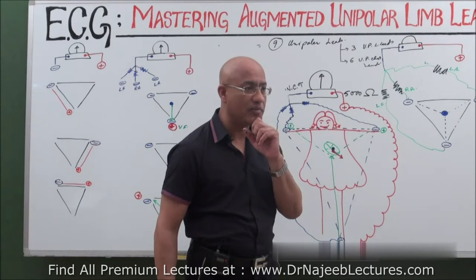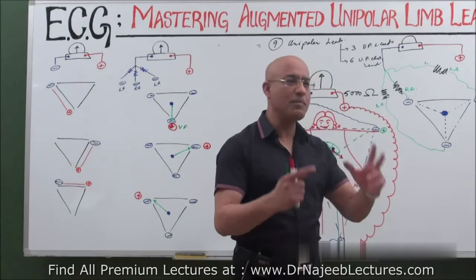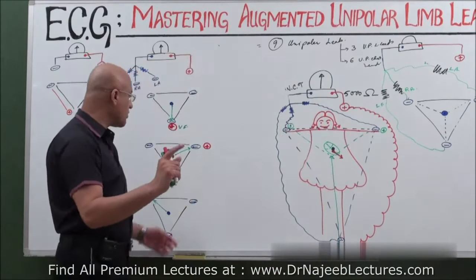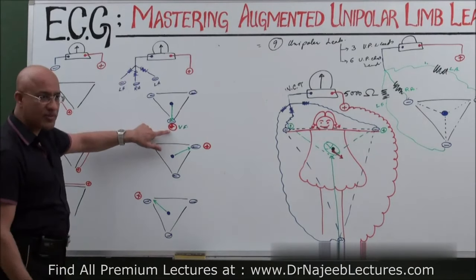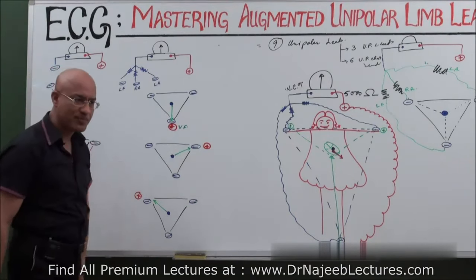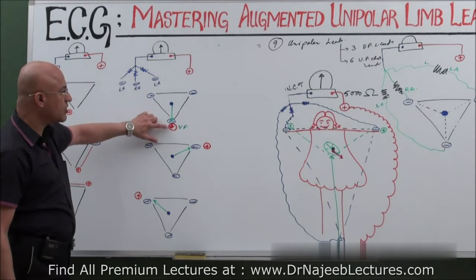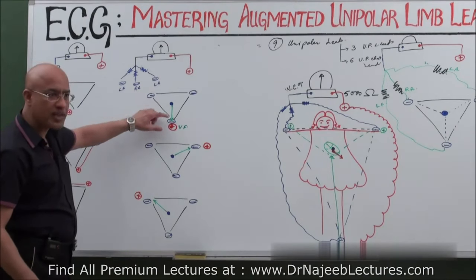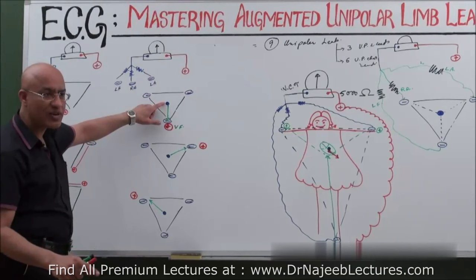So Goldberger and friends came and said, we have to look through a magnifying glass, somehow enhance the voltage. Right? And they came up with a very genius solution. Goldberger's solution was very simple. He said, why is the voltage less? The reason being, wherever you put the positive, there is also negative. These partially positive and negative cancel each other and voltage drops. You understand it? There were two problems. Number one, the voltage is no more against the negative; it is being picked from here against the indifferent electrode. The exploring electrode is referencing itself against the indifferent electrode, so voltage is dropping.